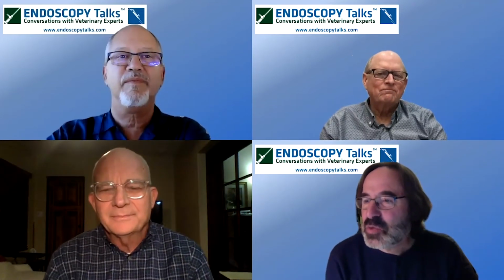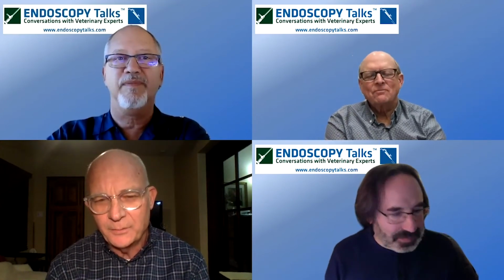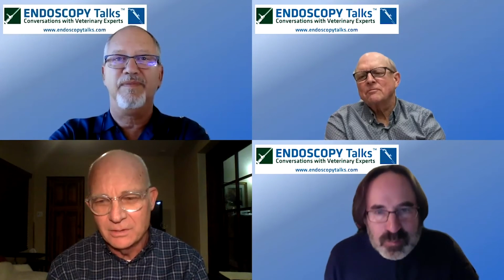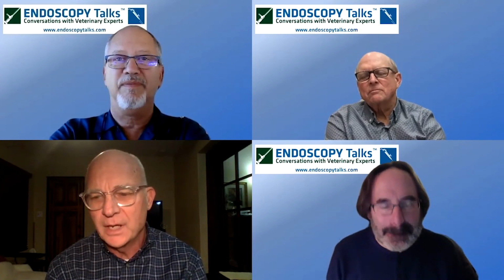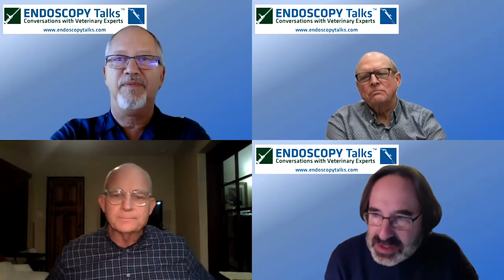So other panelists, do you have any ideas you think could be successful with this, or are you going to call the surgeons? I'm going to say something I've done with different types of things: maybe getting a balloon, using an old esophageal dilator. If you push it through there and then expand it into the center, that would keep it aligned and maybe strong enough to pull through. I don't know. Okay, excellent point.